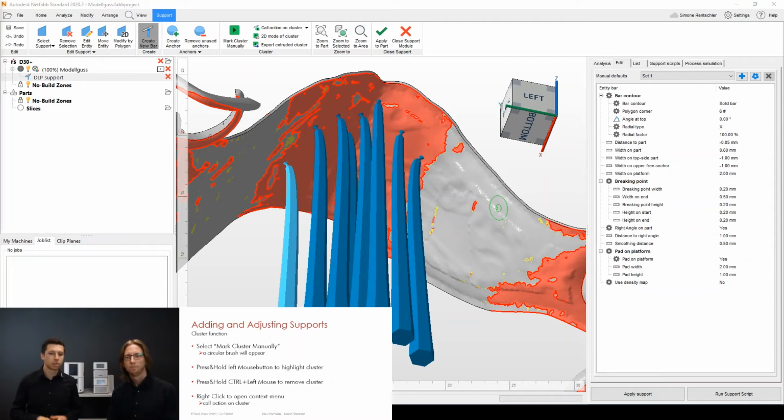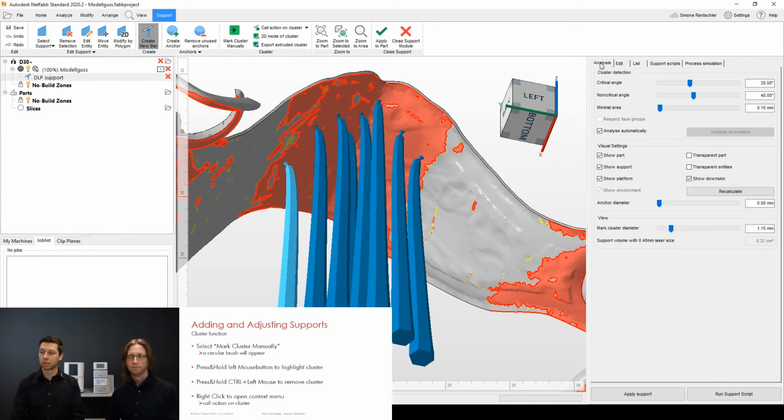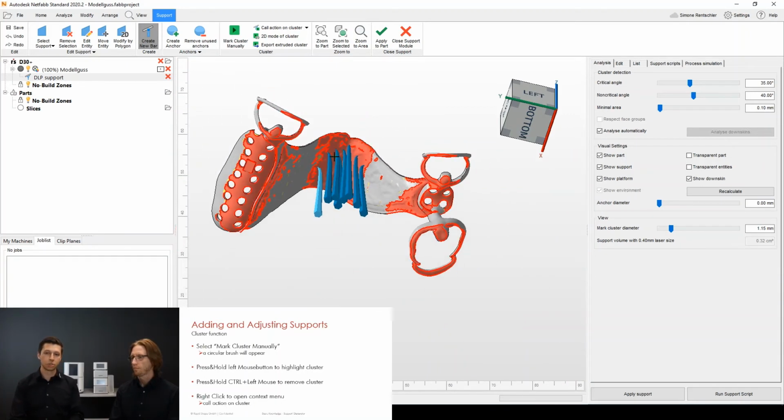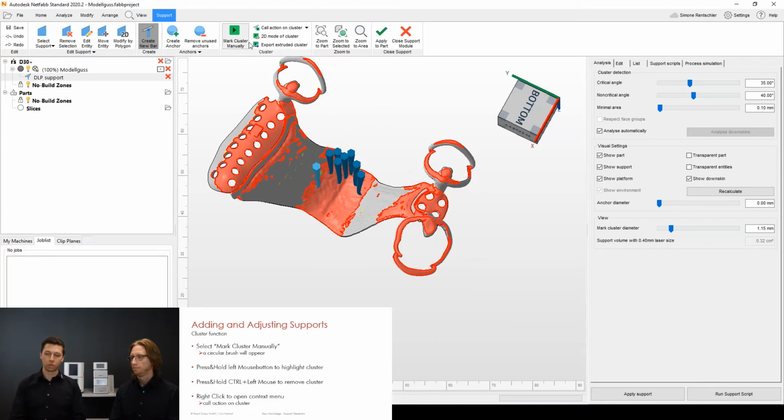It's all about the cluster function. So as I mentioned in the beginning, the automatic detection is done in the analysis, which is then showing you the red and yellow areas according to the values you have entered in the critical, non-critical angle and minimal area. But it's also possible to select or mark a cluster manually. So in case you just want to have a certain area supported, you can just mark this area wherever you like.